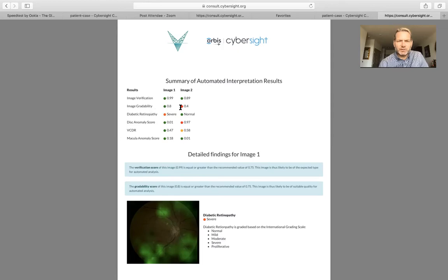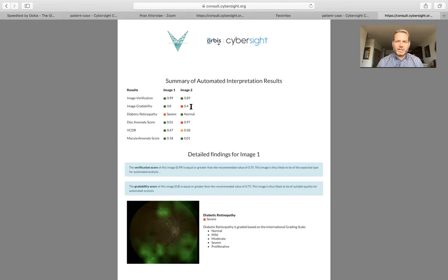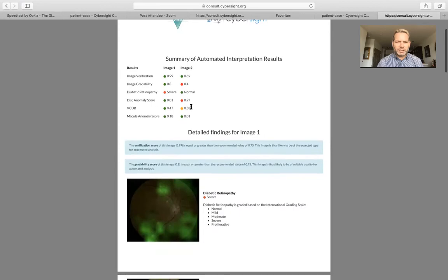You can see that on the second image it had a little trouble with the gradeability. What does it mean if the gradeability factor is yellow or red instead of positive green? It simply means that you want to be a little more cautious with interpreting those results because there's something the system didn't like about that photograph, and so the confidence interval is a little bit lower in that case.